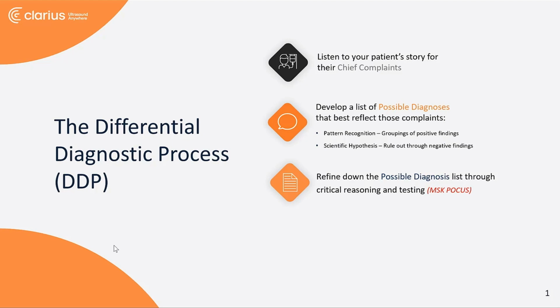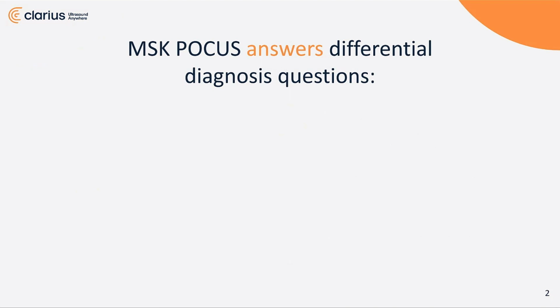In physical therapy, we use manual testing like muscle strength testing, joint stability testing, or evaluating a person's gait. But the whole goal remains the same, and that is how do we get down to our working diagnosis with the best accuracy? Because it is in clearly working out what that working diagnosis is that we are able to obtain the best outcomes. And I'm proposing for your consideration that musculoskeletal ultrasound imaging can be used very well to uncover what that diagnosis is.